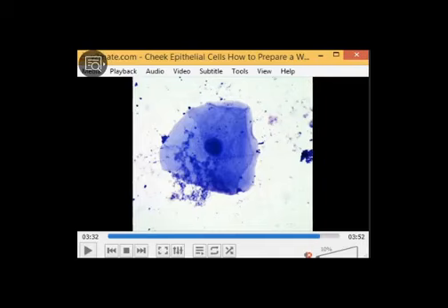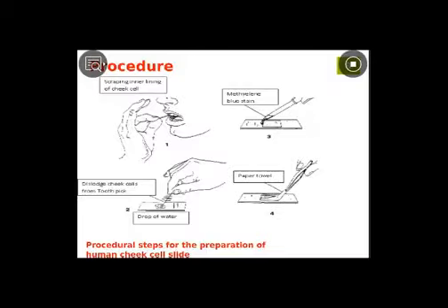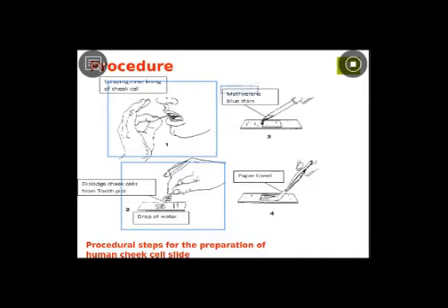Dear students, this is the procedure of making human cheek cells. The same thing is shown in this picture. Yani, take the sample from the mouth, filfam, put it in water, mix, then add methylene blue and put the cover slip, and just see the specimen fil majhara.